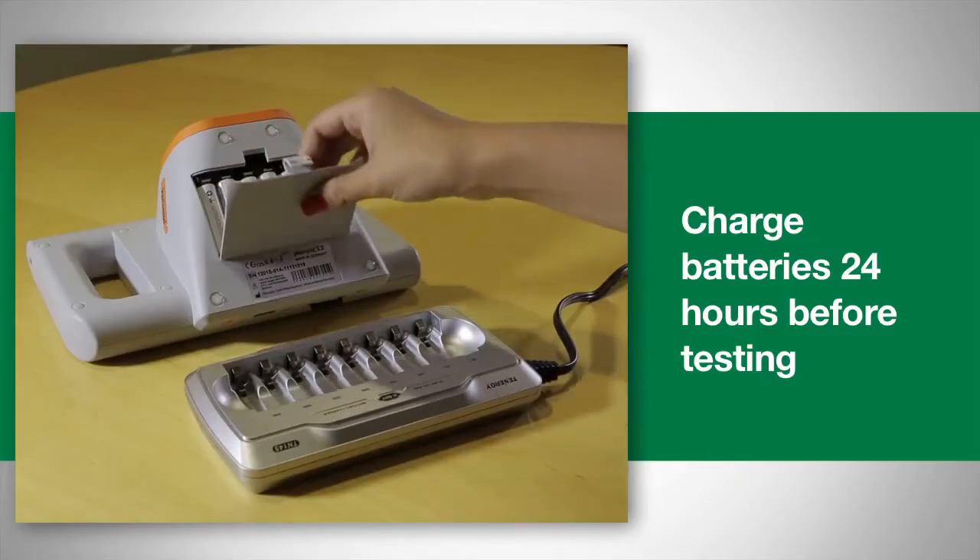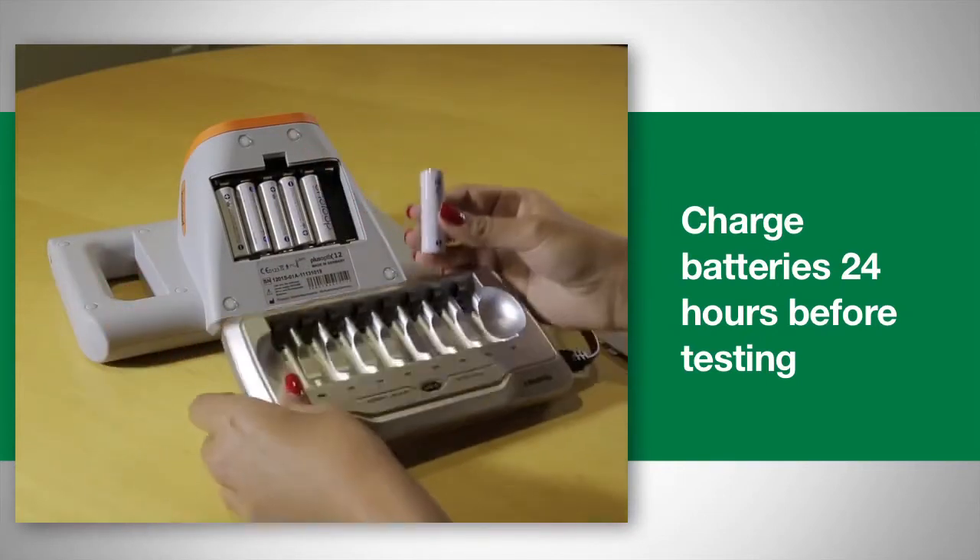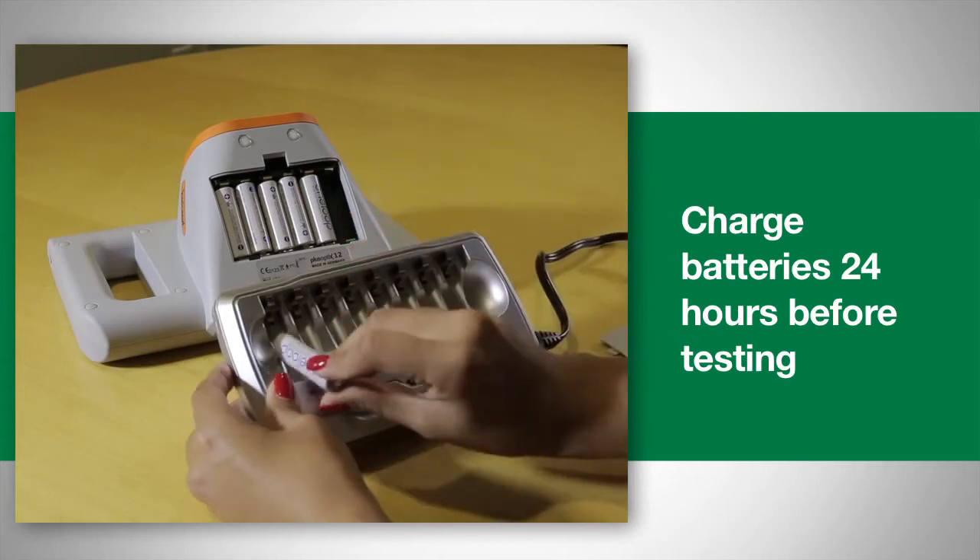Make sure your batteries are fully charged. It's best to fully charge them 24 hours before testing. If the batteries are completely dead, they will need to be replaced or charged using a battery charger.